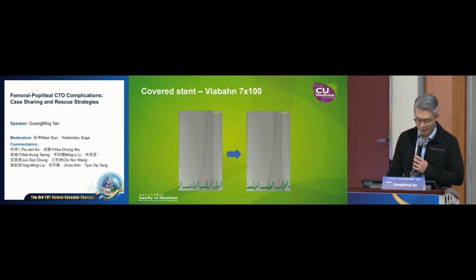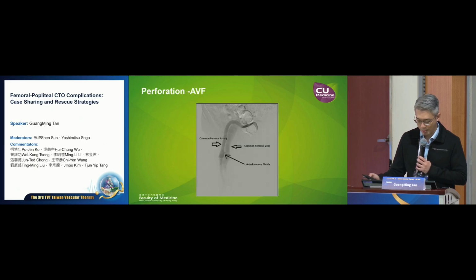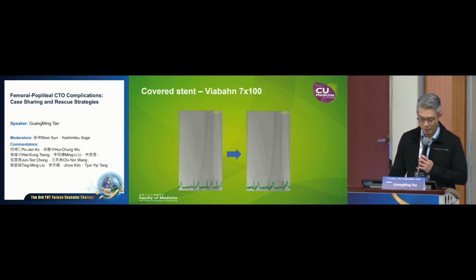So in these cases, actually the perforation was not sealed off with just simple prolonged balloon tamponade, and at the end we have to place a Viabahn stent to seal off the perforation.